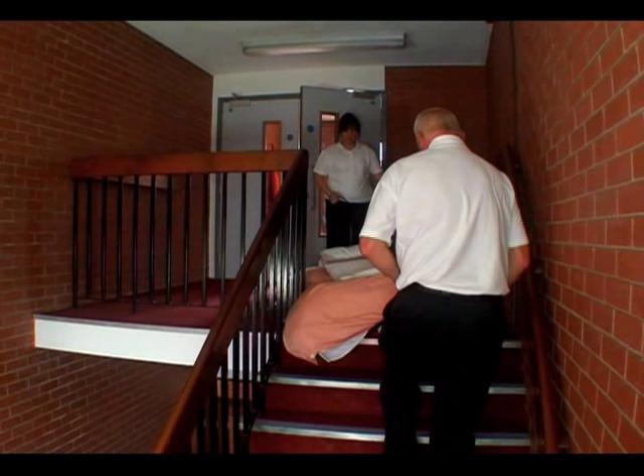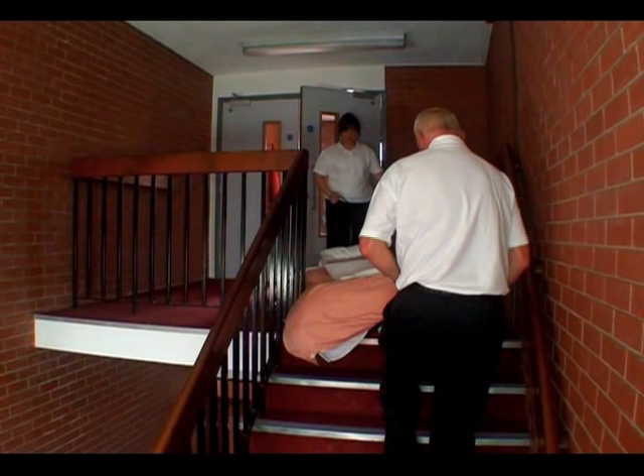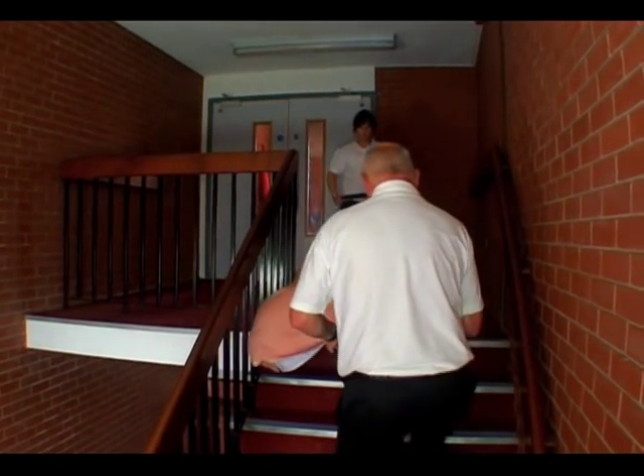As the mattress comes onto the staircase, it is usual for the person at the top to hold the pulling handle long with legs slightly apart to assist their balance. It is the person at the lower end who is in control of the speed of descent, and they should start with the handle short and gradually lengthen it as the descent progresses.